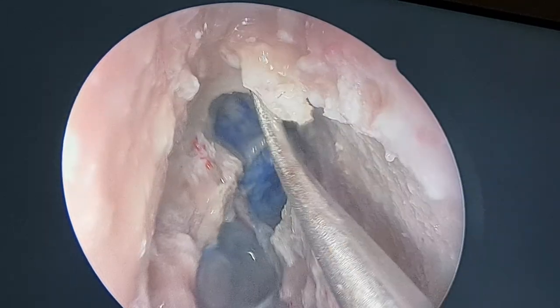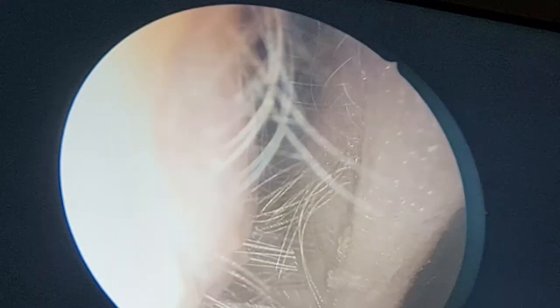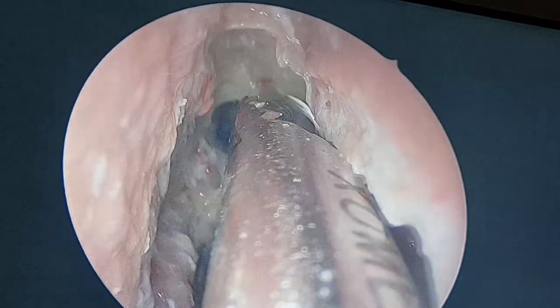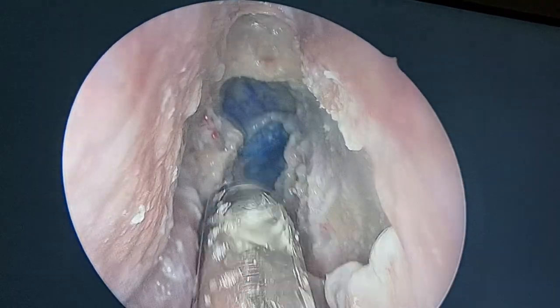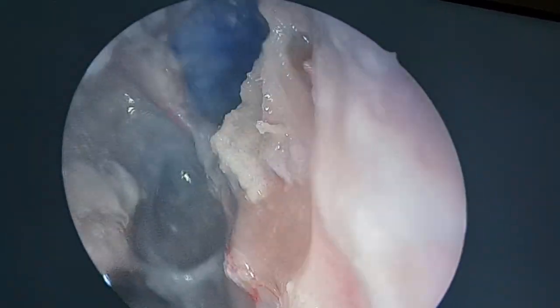Yeah. This whole beak has to go. Has to go. And then the divide up. Change to shaver for a while. You should be able to see each and every nook and corner of the septa. Yeah, frontal sinus. Now again, please.